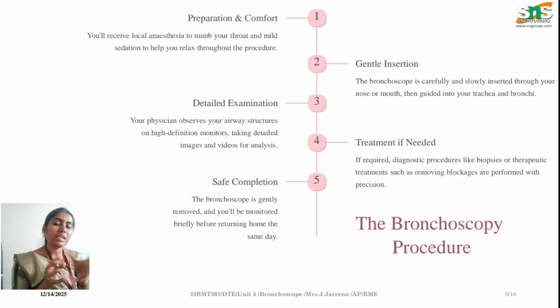And then we have a detailed examination following this procedure. Here we have the option to visualize all the internal structures, which helps the surgeons identify the problems, or any treatments if needed, based on the problems. As I said, if treatment is needed, we can give medications, or if we want to collect samples for further analysis, we can do that. And then finally we have to complete the process.